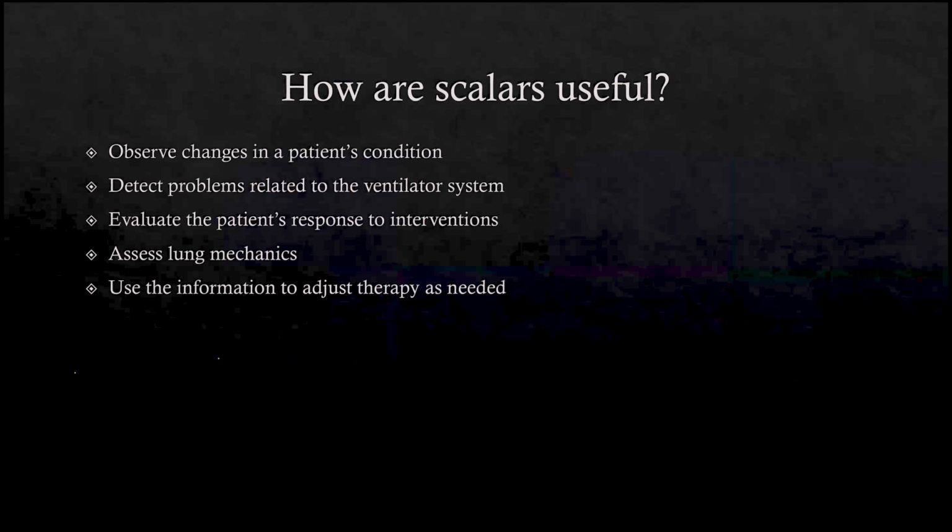Now, how are the scalars useful? They are one of the simplest forms, I would say, of the ventilator graphics, because as I said, there is one variable versus time. So it could be pressure versus time, which the next speaker is going to talk about, or it could be volume versus time, or flow versus time. Now, in my talk, it is volume and flow. Why both of them are connected together? Because there is a more direct connection between flow and volume. In fact, in many of our newer ventilators, the volume is deduced from the flow rather than being an independent variable itself. So flow is very much akin to volume, and I think that is something we need to understand. That's why the flow and volume scalar almost always go hand in hand.